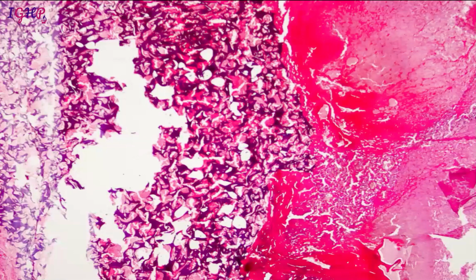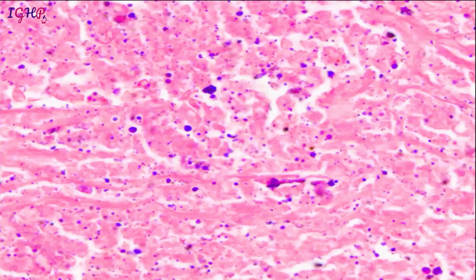Now this is another area where sometimes you will feel that this is the pathology, but this is actually not a pathology. This is a gel foam that is usually seen when you take biopsies and you pack the material with a gel foam, and at times you get those gel foam on your slides also. This is how it is going to look like. So it is just an artifact and it is not a pathology in itself.